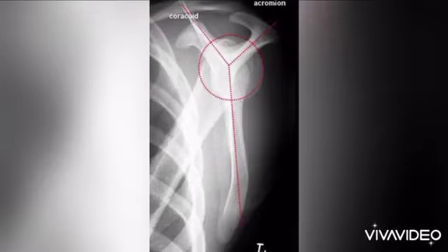In this picture, this is the coracoid and this is the acromion. And this is the body of the scapula. So that's why this is called a scapular Y.